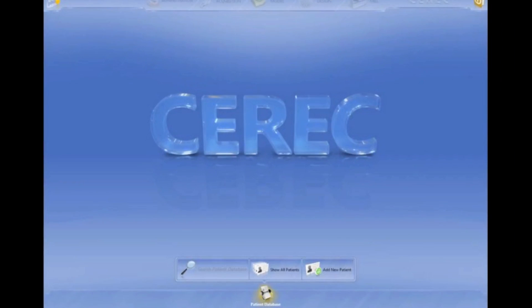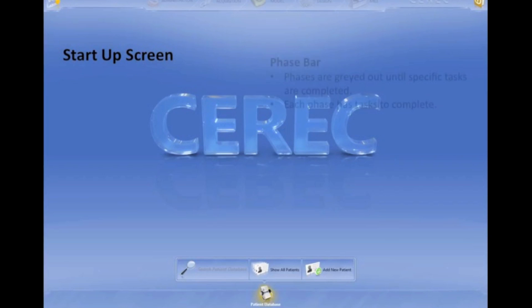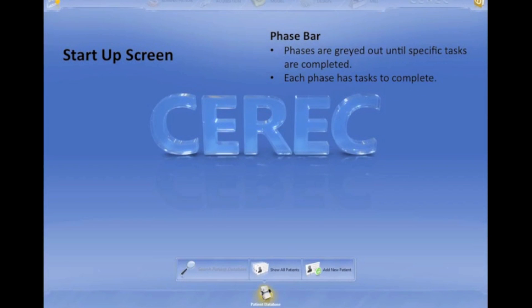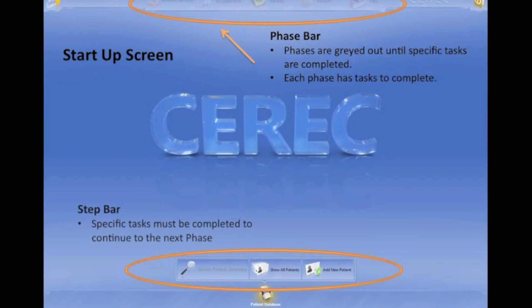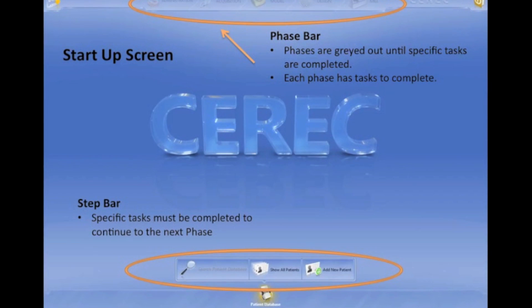Alright, this is your start screen. When you first start up the program, at the very top you have phases. Your phase bar is going to tell you what phase you are in the whole process of going from A to Z. Now at the bottom, I love this — it's a step bar. It's going to give us our tasks that need to be completed during each phase.